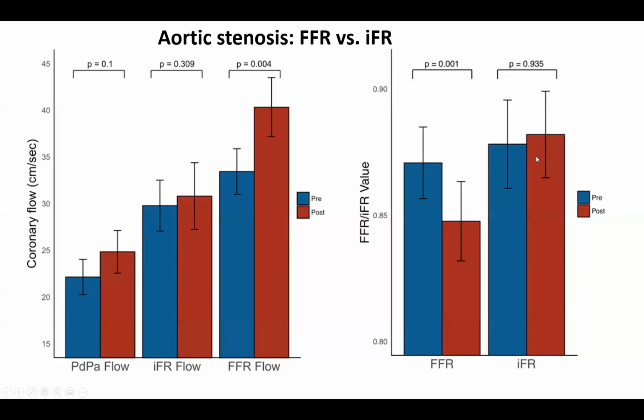Okay, and why is that? In aortic stenosis, the aortic valve acts like a stenosis to the coronary flow, not just to the aortic flow, but to the coronary flow. It's a flow-limiting stenosis to the coronary flow. So FFR before fixing AS is likely to underestimate lesion severity based on the serial stenosis concept. On the other hand, because IFR is less dependent on a dramatic flow rise, it's less affected in AS and is likely more reliable, as in the serial stenosis concept. So in aortic stenosis, use IFR, not FFR. This is beside the fact that adenosine may be unsafe in aortic stenosis anyway.